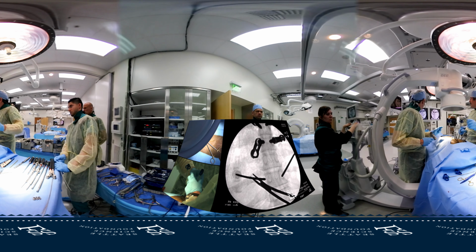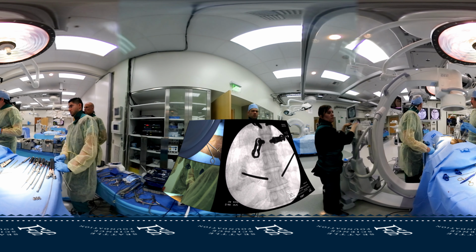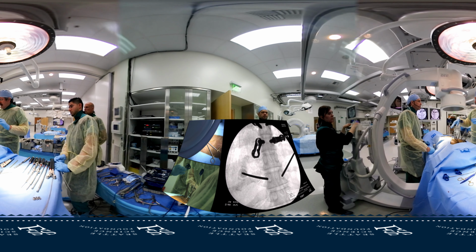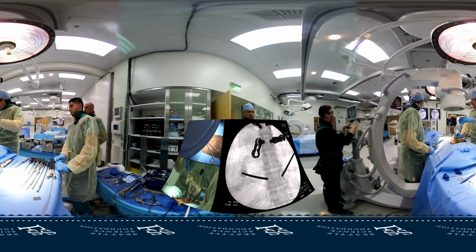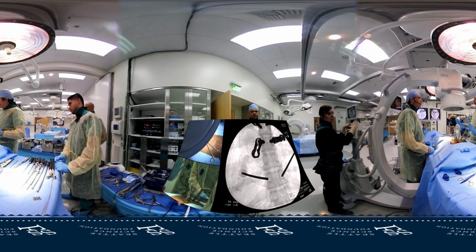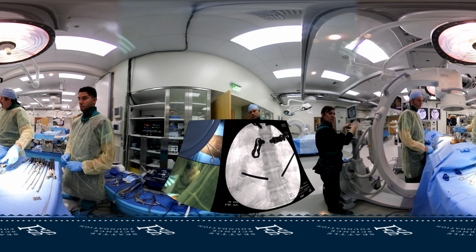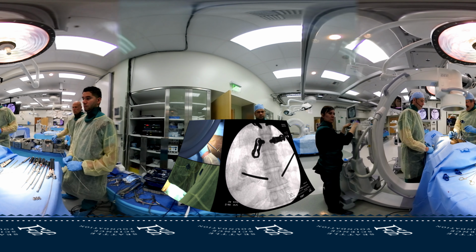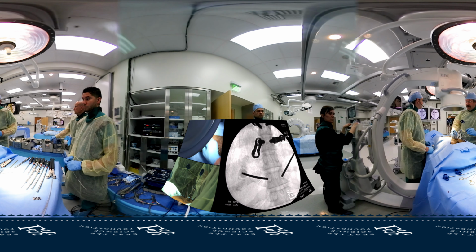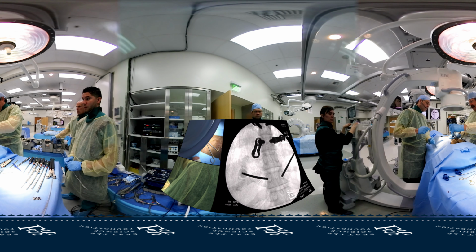That feels better. Picture. A lot of times you can feel it drop into the pedicle, and you can feel good. So if you see here, we've got two that are started. Mine might be heading a little more medial, but when I've got it just into the bone, I can make adjustments. And I'll try to work off the AP most of the time. So once I've got it in the bone and I can see Andrew's, if you can look here, I'll use my finger because I want about 1 centimeter or so for it to go in, and I'll just mark the pin, and I'll stay in.